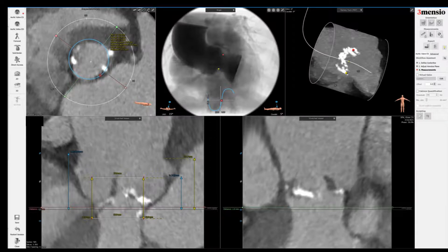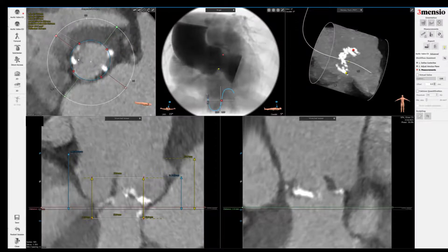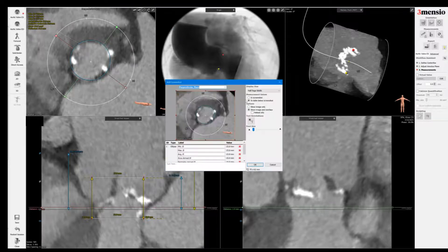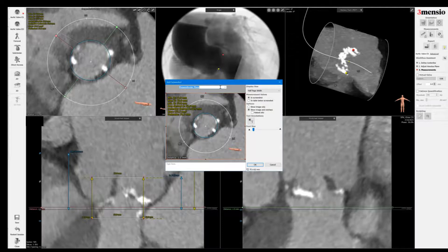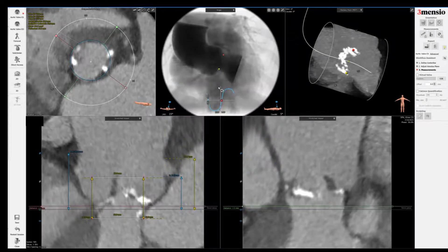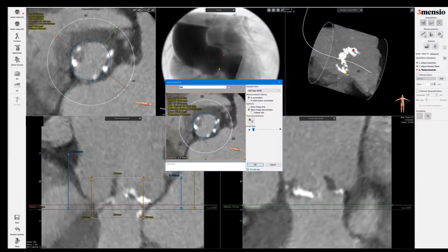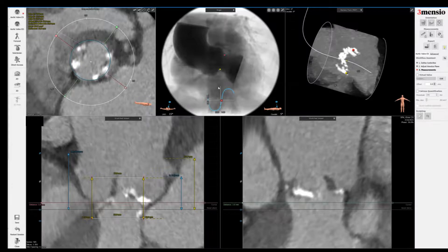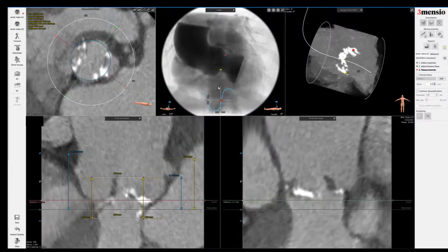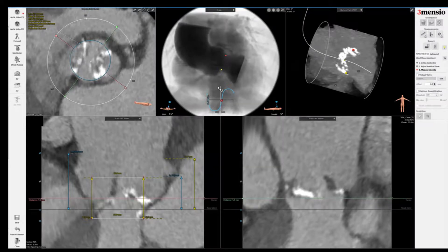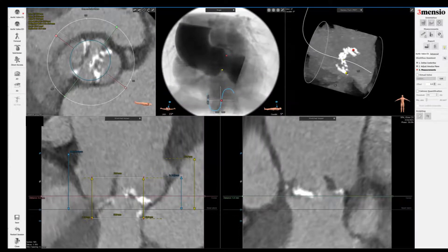If you use a self-expanding valve, you can pick the waist of that valve size to mimic the virtual implant, because you want to see where the calcium may sit once you expand the valve. There might be a risk of annular or aortic root injury if you're not careful, so you want to customize your inflation strategy for a balloon-expandable valve. I do my one-millimeter root measurements here, usually up to 10 millimeters, to get an idea of how the valve will fit the particular root anatomy.